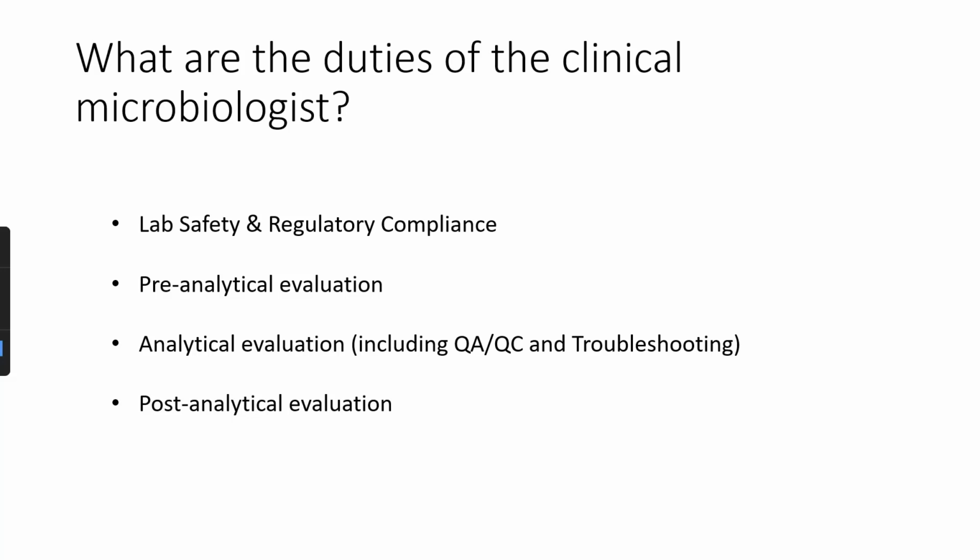It's preferable to have at least three patient identifiers on a specimen. Also collecting the right specimen at the right time, collecting it in the correct container, transporting it appropriately, and processing it once it gets to the lab before we put it on the analyzer. All of those components are considered pre-analytical. That all happens before we actually perform the tests.